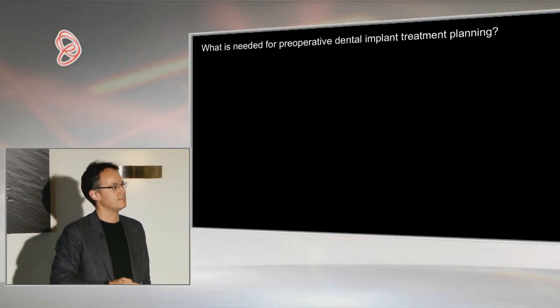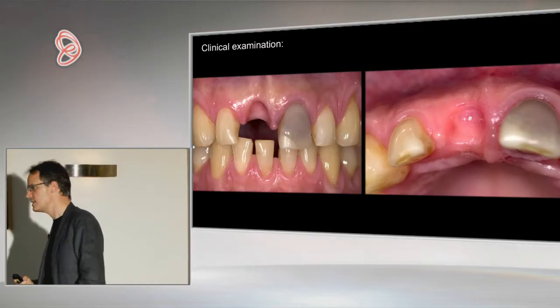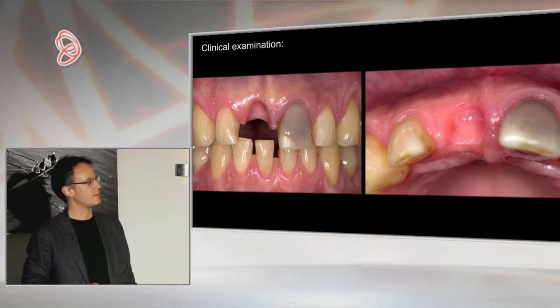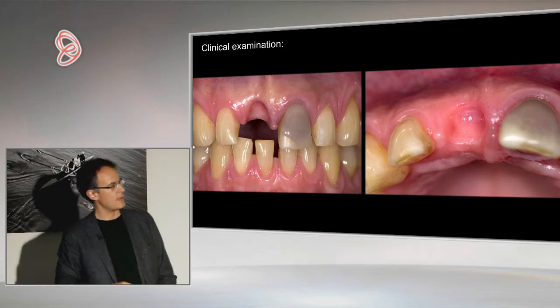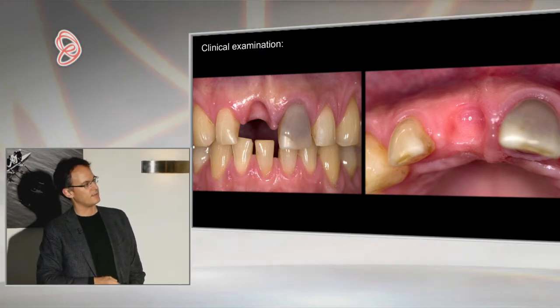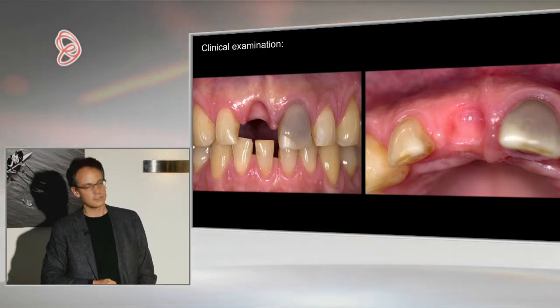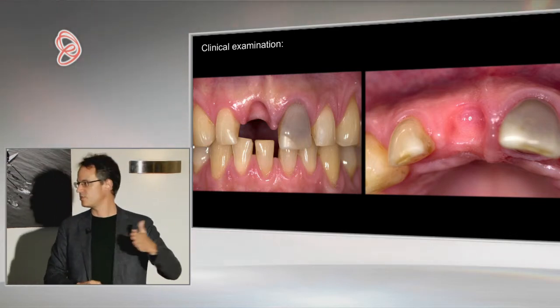So this is a simple case in terms of there's only one tooth missing. It's maybe more demanding, an advanced case in terms of the site. It's an aesthetic site. And it's also maybe not so straightforward, because placing an implant and doing a reconstruction here, I think you should also address this lateral here. That's always some basic question you have to look at.